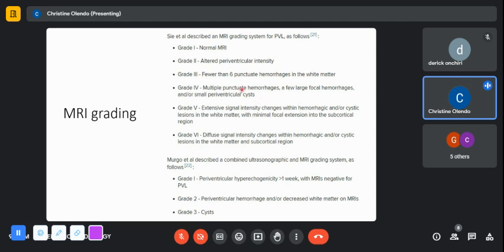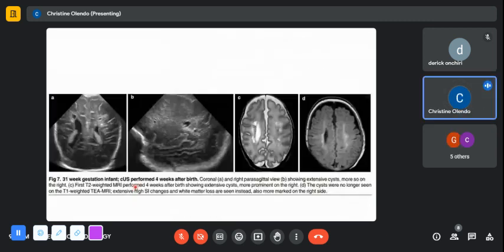So those are the 2 grading systems I came across. I think Sai et al. sounds more specific. So this would be summarized. Even 2 summaries for ultrasound. So we'll go through images again.